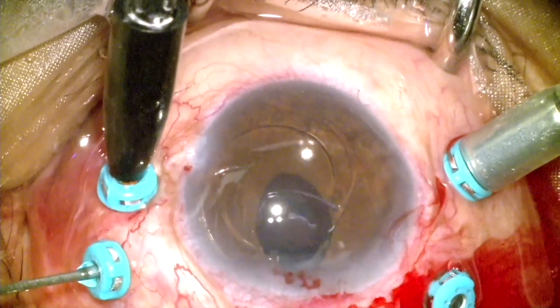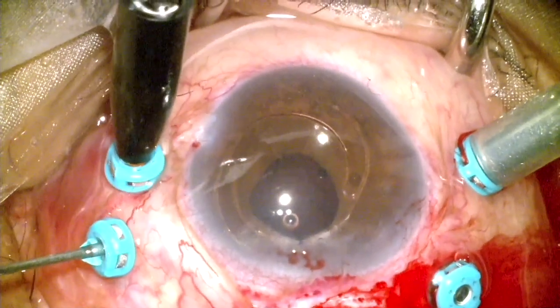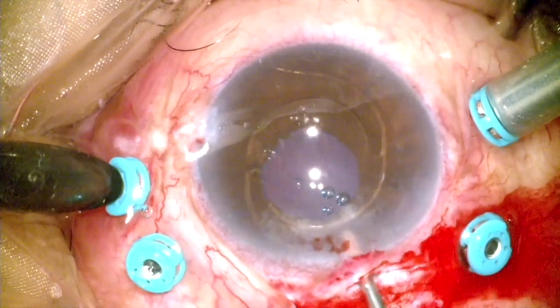Having done that, I cleared up all the bubbles that were present in the anterior chamber and in the vitreous. I was quite fortunate to have an attached retina. There were no tears. After examination, I closed the case.